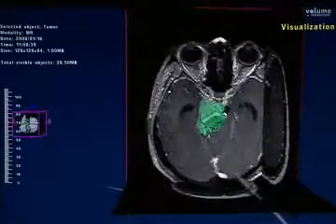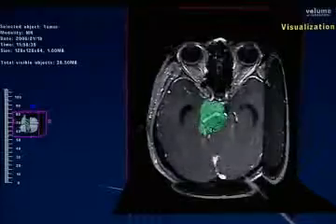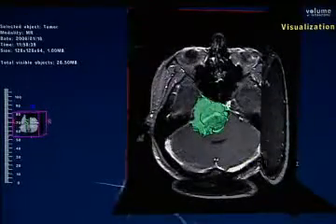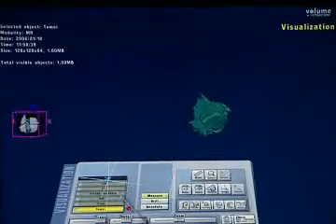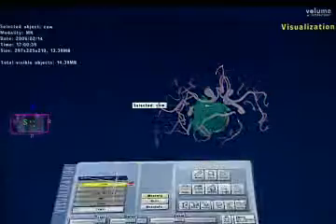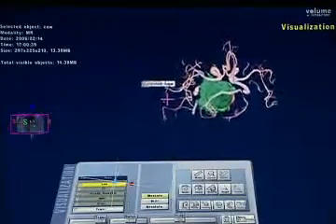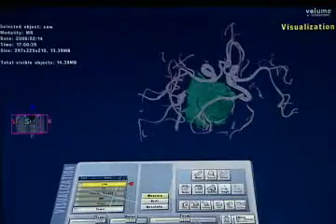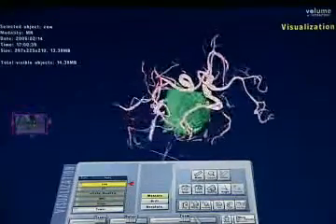So you can see again the structural lesion in 3D. You can put them in and do a number of combinations. And in this situation, it's just 2D MR and the 3D tumor. You could then, of course, add the vascular structures. In this particular instance, vascular structure and distortion is critically important if you're going to end up with a reasonable result with surgery. You need to know where your vasculature is going to be.